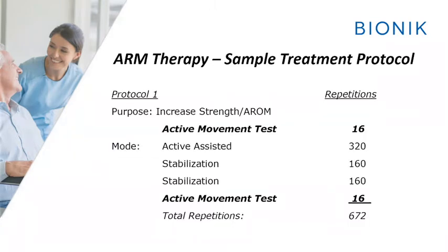For this patient, the above protocol was used to increase motor control and mobility of the arm into all planes of movement. The average time for treatment can be as short as 30 minutes, with achievement of anywhere from 400 to 600 repetitions as recommended in the neuroplasticity research. Of course, we know that the current norm for traditional treatment is an average of 30 to 45 repetitions in a 50-minute session. And this patient was able to achieve approximately 600 repetitions within a 30-minute session.